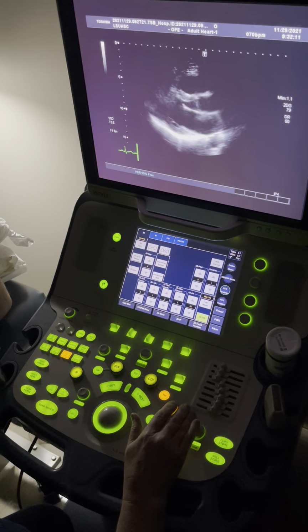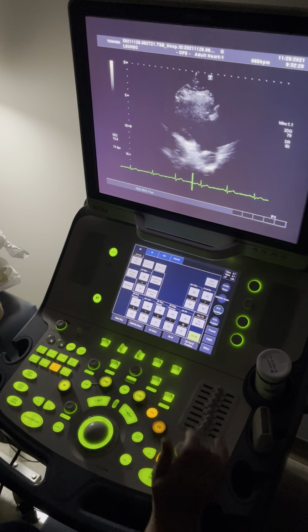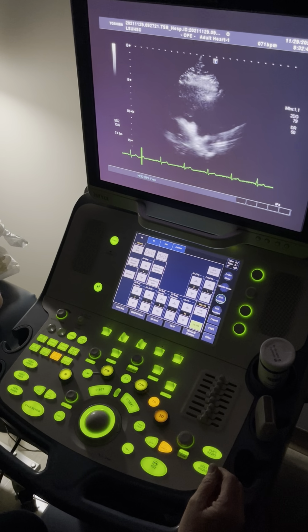I go to RV inflow. So much easier to find the right things to press in this machine. It's easier to find whatever we need to press in this machine. Oh, that's because you learned it over here. But the other machine does have new imaging technology, so it makes it easier to get crisper pictures.